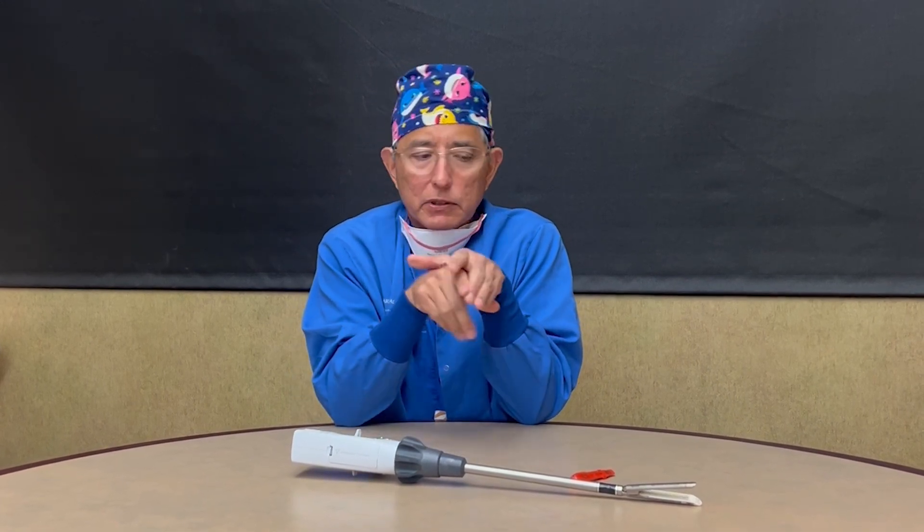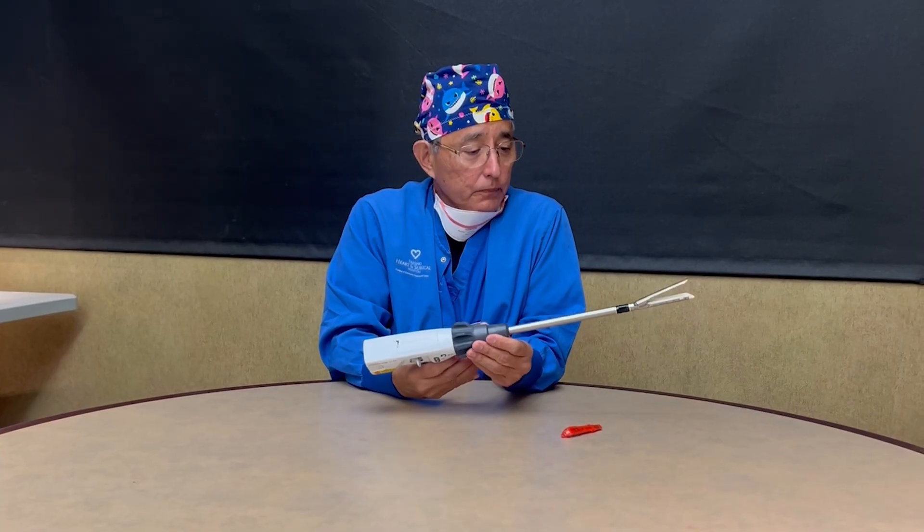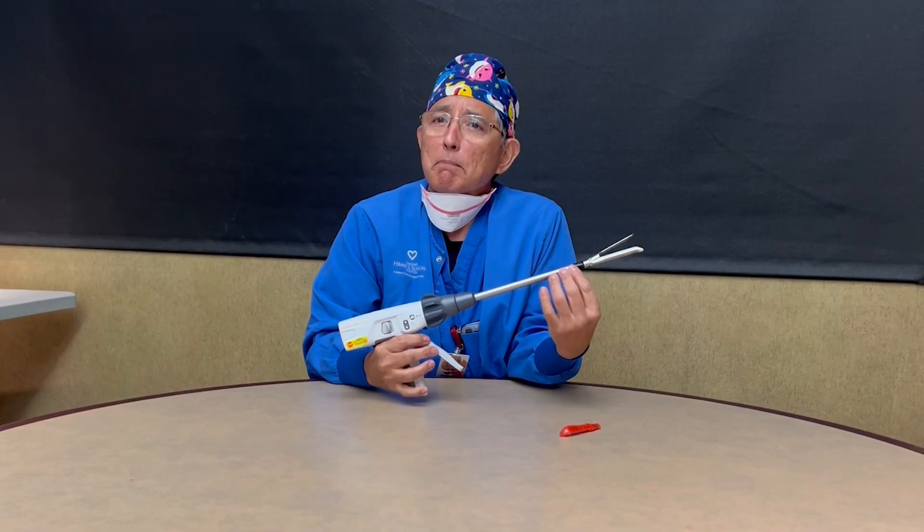When we used the 3000 and were coming across the stomach endoscopically, you could see the mucosa sort of heap up a little, as if it's not compressed quite as well — it heaps up as a little mound. In this first firing with the 4000, it was completely flat, as if things were more stable. I think the stapler just makes me a better surgeon.